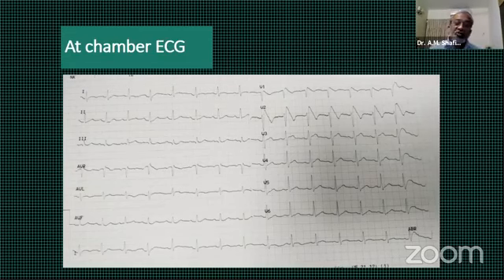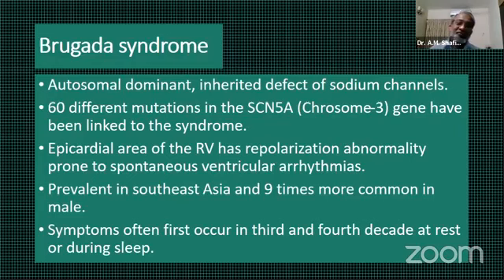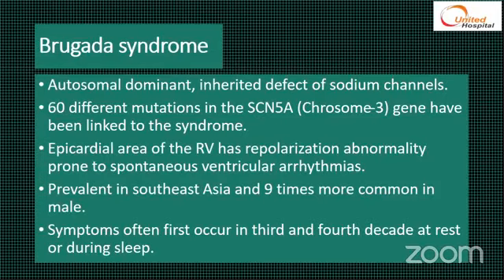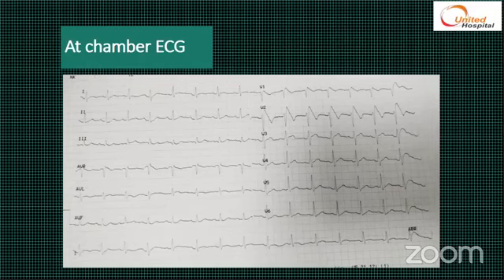So if we go into the details of Brugada syndrome, just to have a glimpse. Bhai, one second, if you allow me to say this. In life, it's not like cricket that we just go for a 6 and then become a hero. If you can, that's all good, but have a differential. If this patient has palpitation, is 36 years old, and has ST elevation and this pattern, and you are confusing it with STEMI, make a differential about Brugada, but still you are in doubt and somebody is on your nerves, what else can you do in the acute setting in the emergency room?